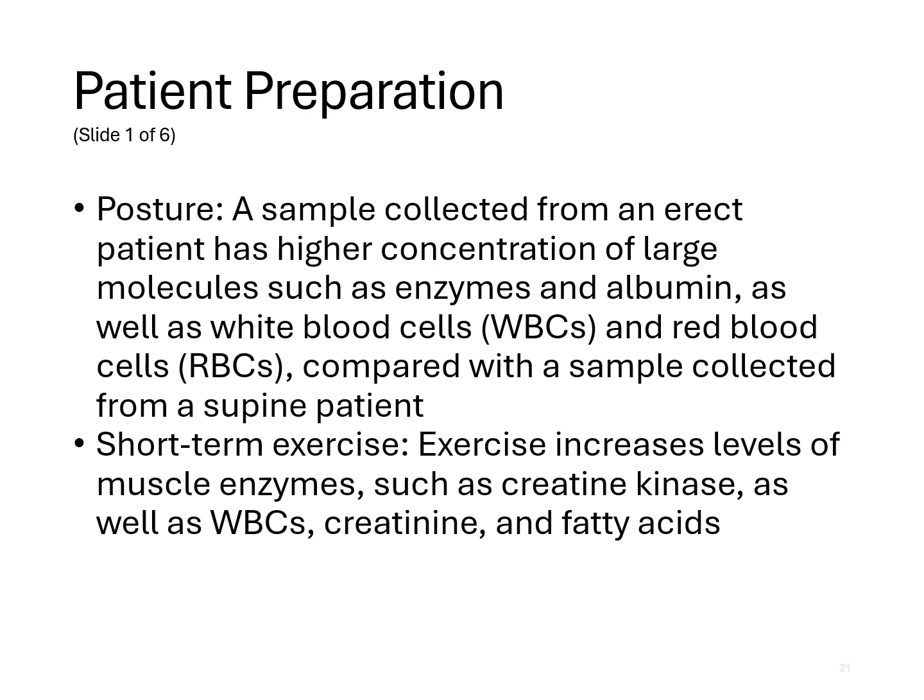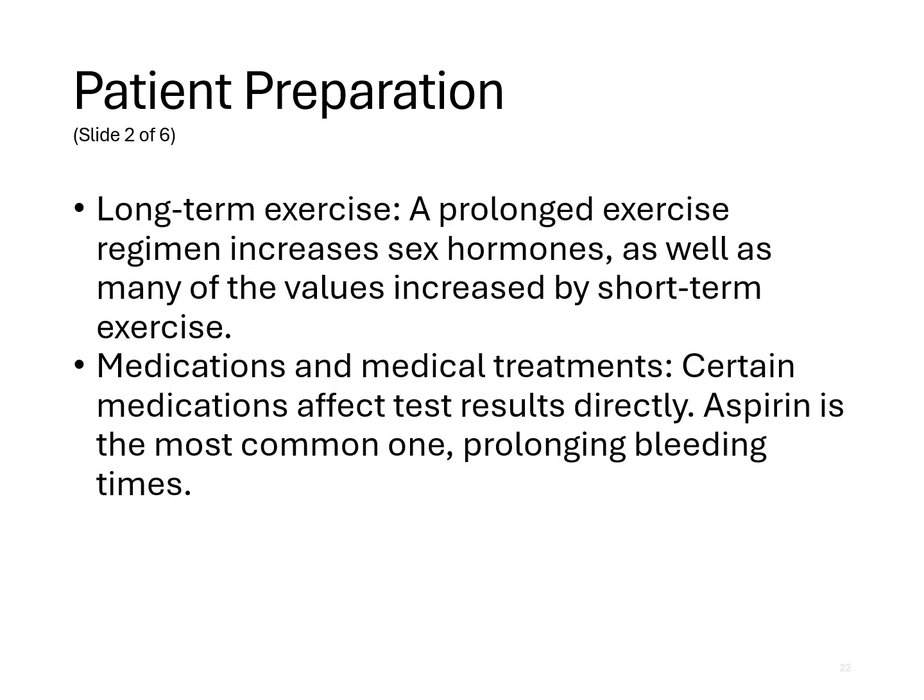Patient preparation. So we have posture. A sample collected from an erect patient has a higher concentration of large molecules such as enzymes and albumin, as well as white blood cells and red blood cells, compared to samples that are collected from a patient lying down. Short-term exercise. Exercise can increase levels of muscle enzymes like creatine kinase. It can also increase your white blood cells, creatinine, and fatty acids.